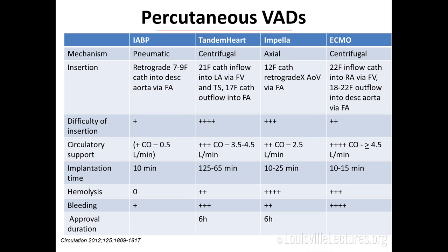So balloon pump is a pneumatic device, blows up and deflates in the aorta. It goes in retrograde through the femoral artery, and we put it retrograde up the aorta. It's very easy to do, relatively speaking.